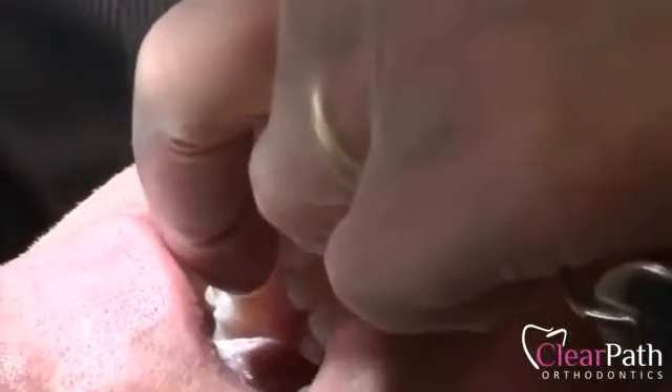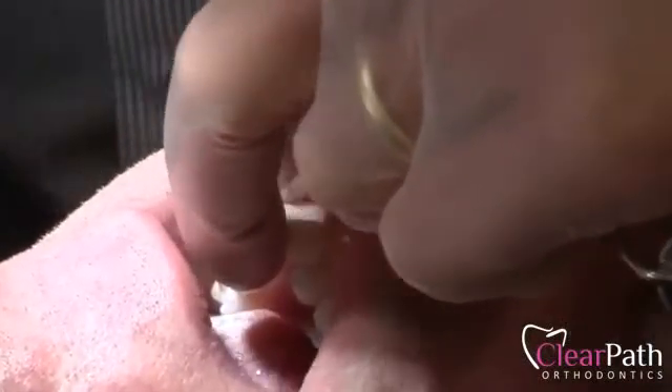This is a very safe technique. It does remove some of the enamel, but there's a large portion of the enamel still present.